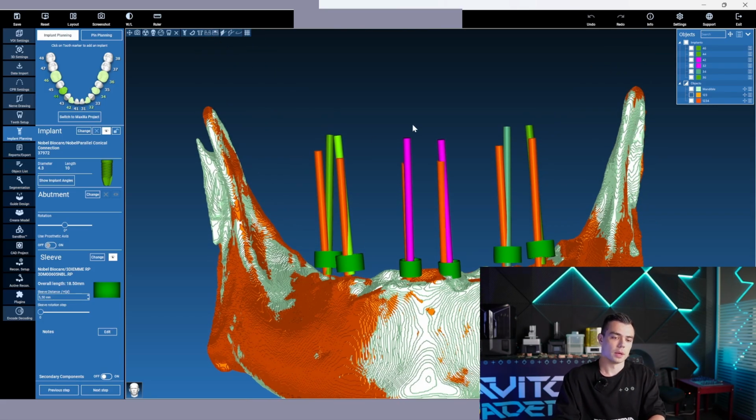But anyway, whether you consider this surgery successful or not is absolutely up to you. I hope you will use this technique in order to estimate the accuracy of your implants, and I actually think it's quite a useful technique to use during your daily work.